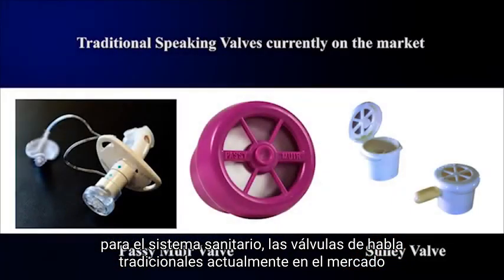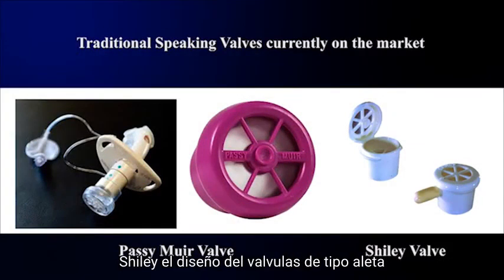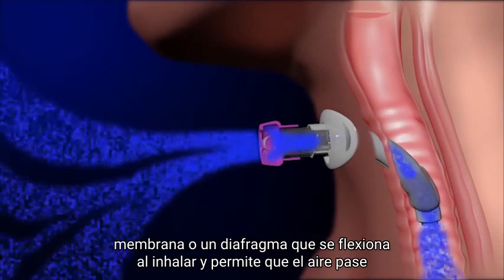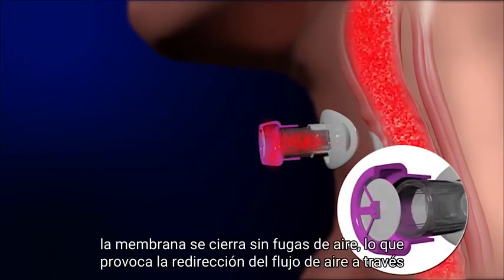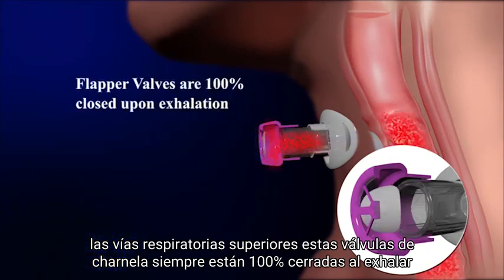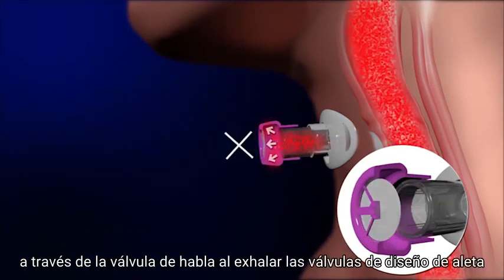The traditional speaking valves currently on the market are flapper-type valves, which include those manufactured by Passy-Muir and Shiley. The design of the flapper speaking valves, which has not changed since these were first introduced in 1985, includes a membrane or a diaphragm which flexes upon inhalation and allows air to pass through the tracheotomy tube. Upon exhalation, the airflow is reversed and the membrane closes with no air leak, causing redirection of airflow through the upper airway. These flapper valves are always 100% closed upon exhalation, a feature that is called bias closed, which means that zero air is allowed to go through the speaking valve upon exhalation.